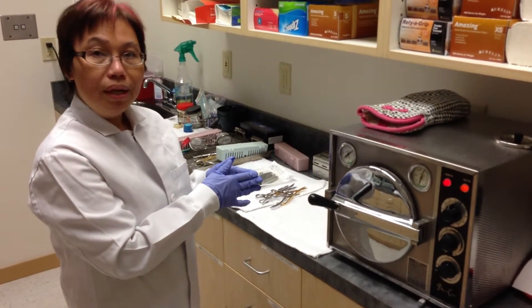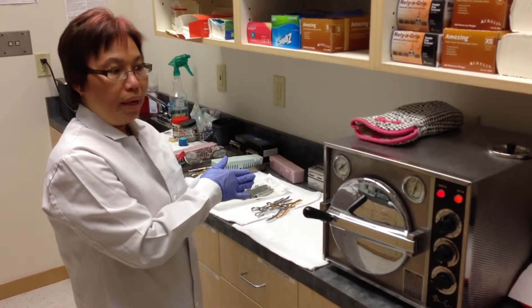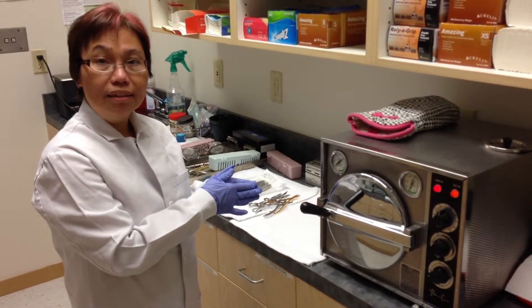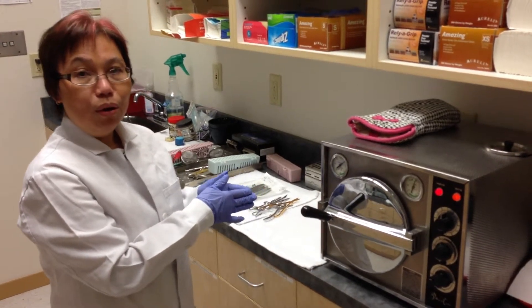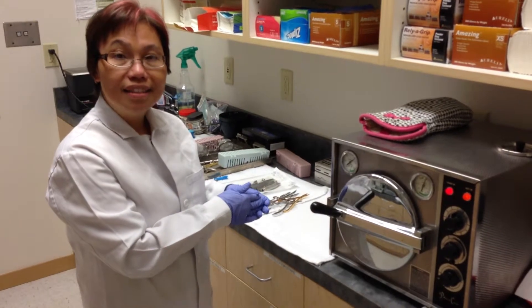Every week, we run a spore test that we send to the lab to make sure that our sterilization procedure is done correctly to kill all of the virulent bacteria. We go above and beyond to keep our patients and us safe and healthy.